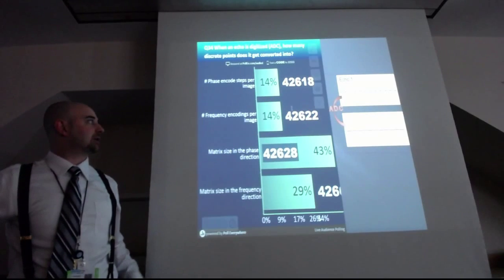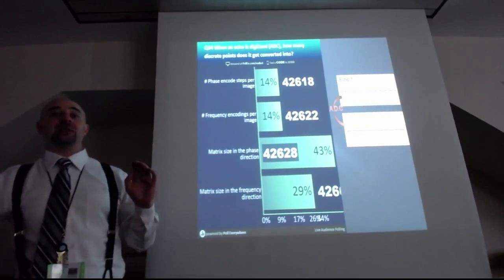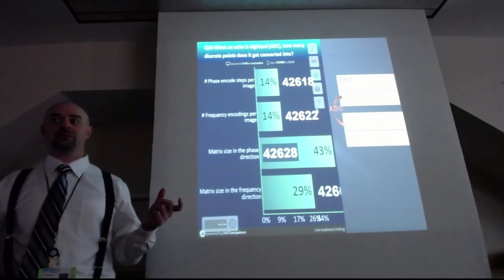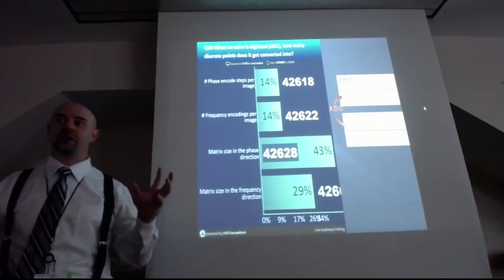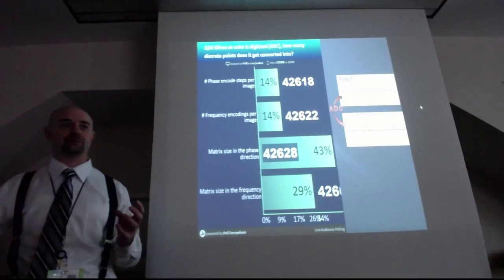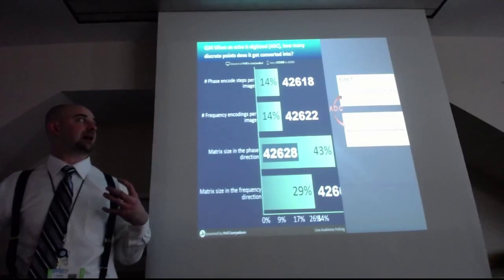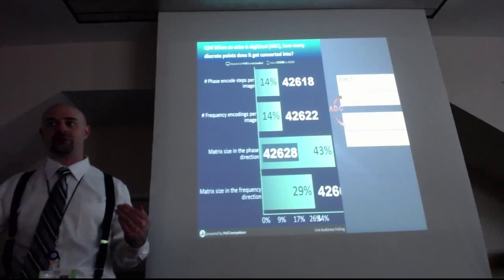This is probably one of the most confusing parts. At the end of the MR experiment, we have on the frequency encoding gradient, and we collect an echo, right? And that's this analog standing waveform inside of the bore of the magnet that we're listening to with an antenna. We have to turn that echo into something a computer can handle. That's the analog to digital conversion process.